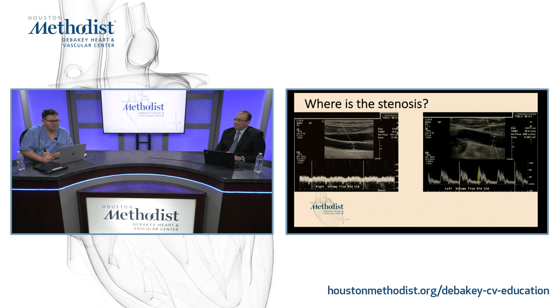So this is why it's so crucial that in each protocol we do, you need to have a bilateral blood pressure done. With that one waveform, it tells you the whole story, and then you can have all the build-up and look at all the different images to see where the stenosis is. So the good answer, what I was looking for, is definitely a proximal CCA stenosis. I really appreciate the first attempt, and I would like to give you a free registration, but better luck next time.